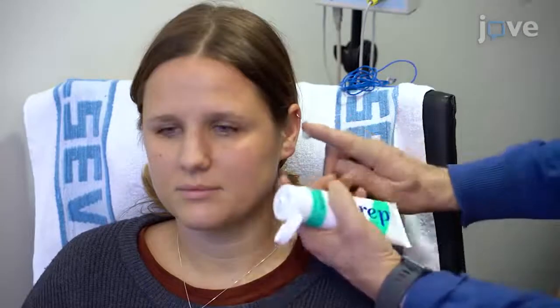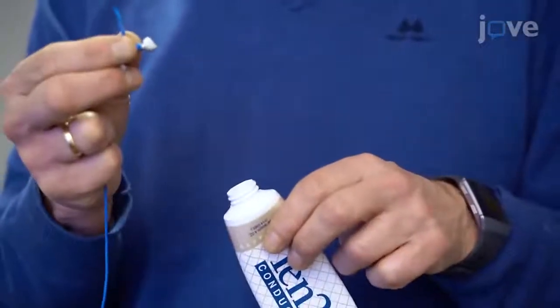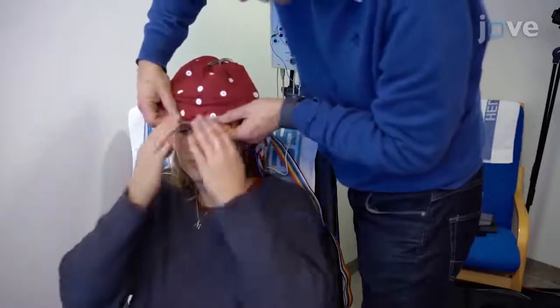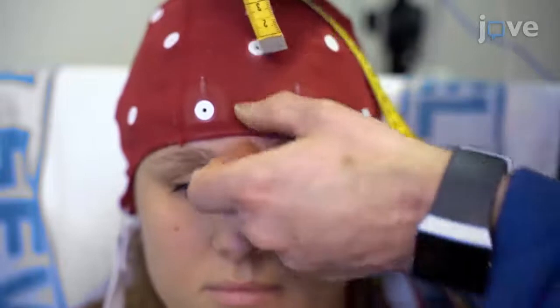Apply skin prep gel to the earlobes and fill the ear electrode cups with conductive electrogel. Attach the ear electrodes and place the cap symmetrically on the head, with the frontal pole electrodes placed in the center of the frontal pole.